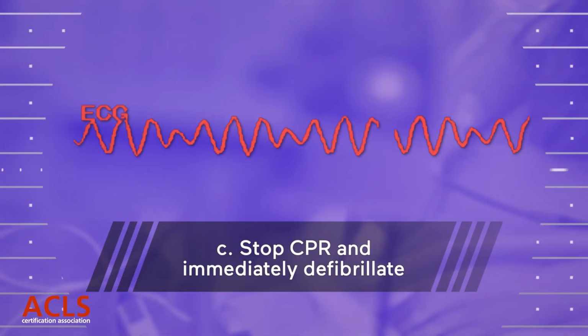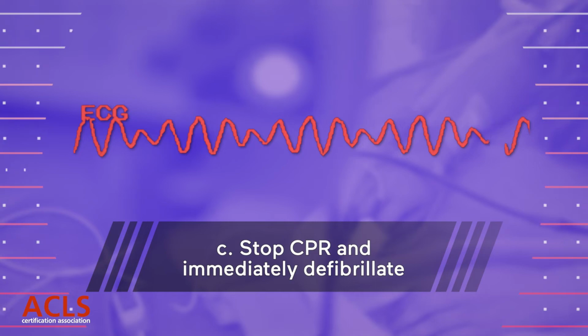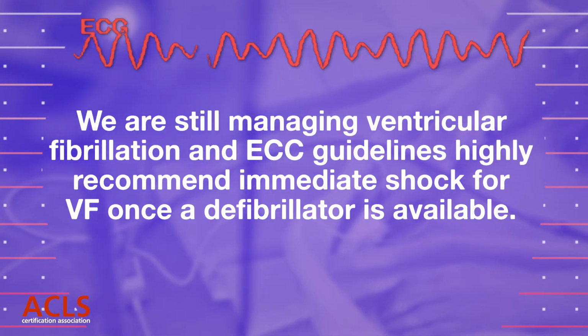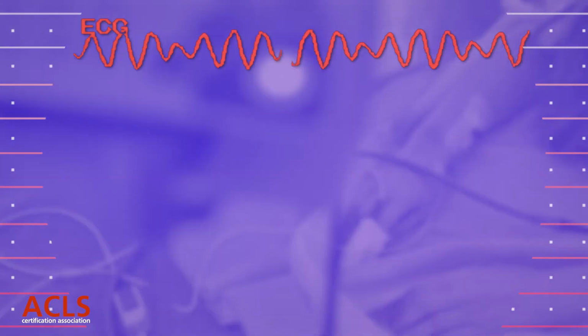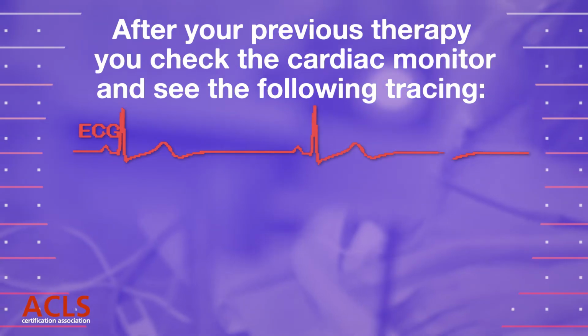Correct answer, C. Stop CPR and immediately defibrillate. We are still managing ventricular fibrillation, and ECC guidelines highly recommend immediate shock for VF once a defibrillator is available. After your previous therapy, you check the cardiac monitor and see the following tracing.